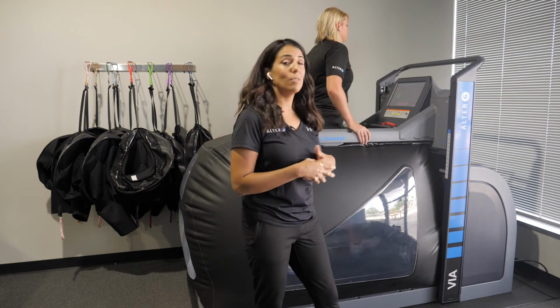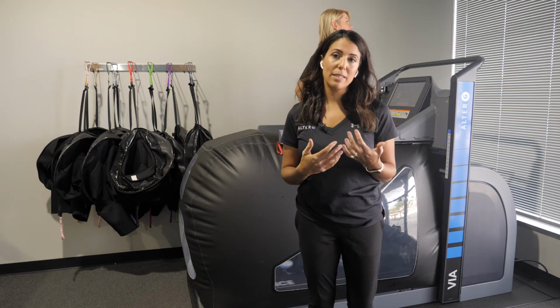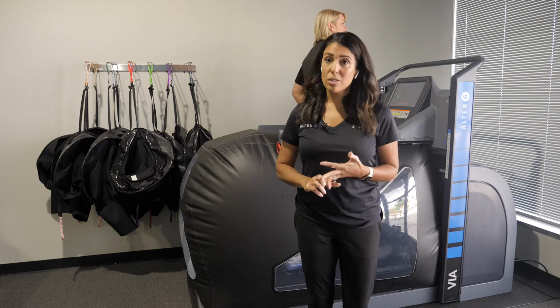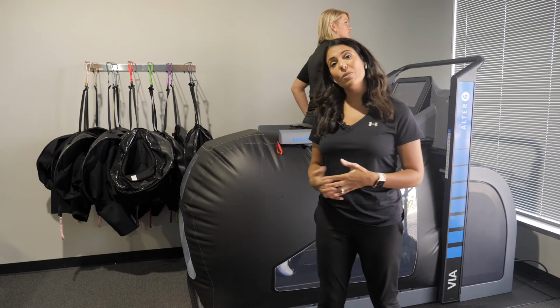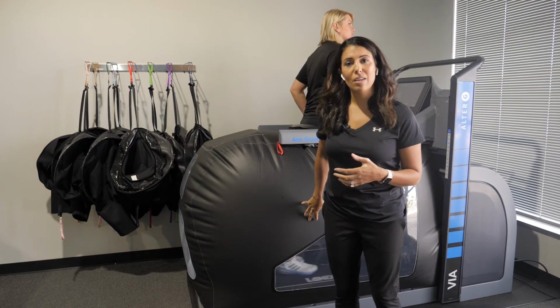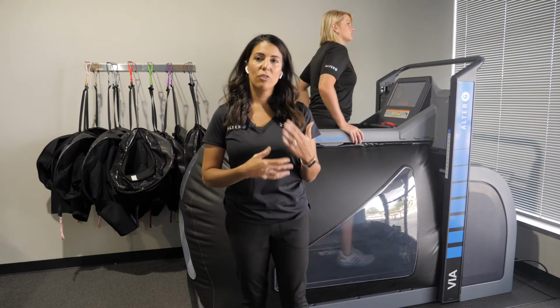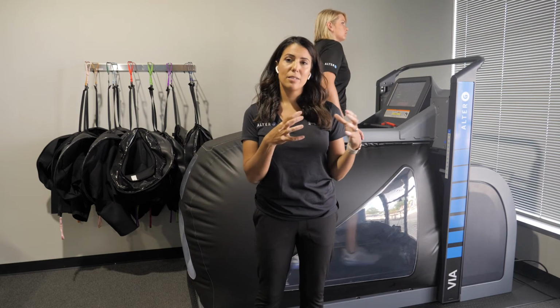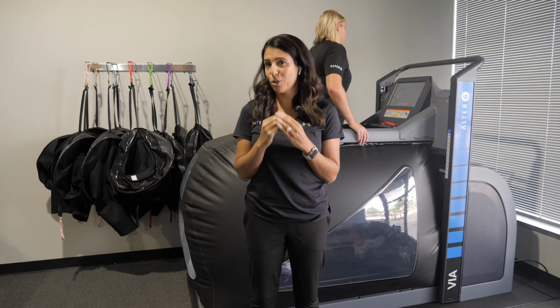So these gait analysis parameters can really benefit you, not only the patient from having that feedback to make their own changes, it can help you justify why you're using the treadmill or why it's effective for your patient, and then it can also help you create that perfect practice condition so that you can have that higher level activity and a lot of gait retraining and practice with the parameters that you know are actually achieving the best symmetrical gait for your patient.